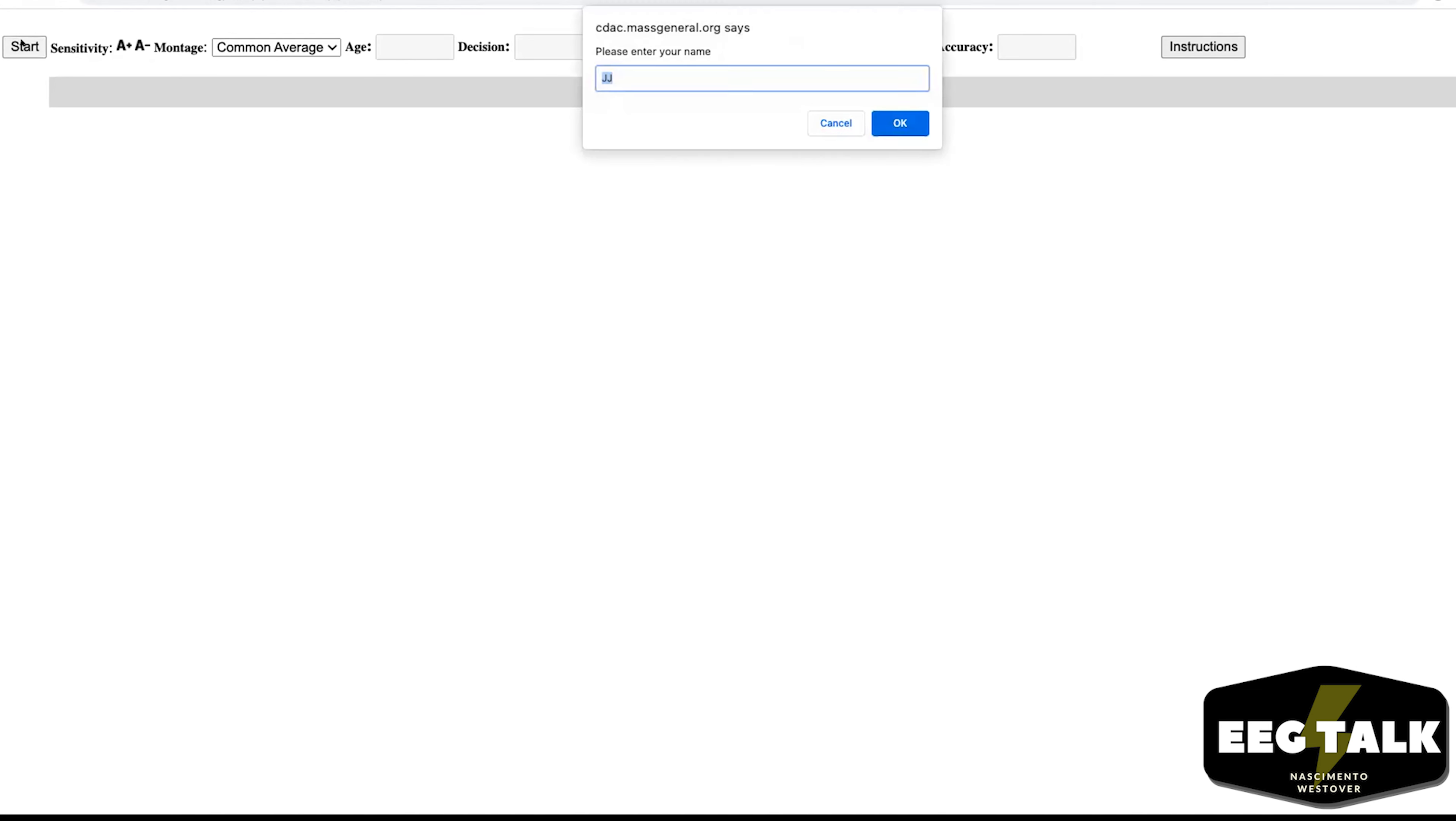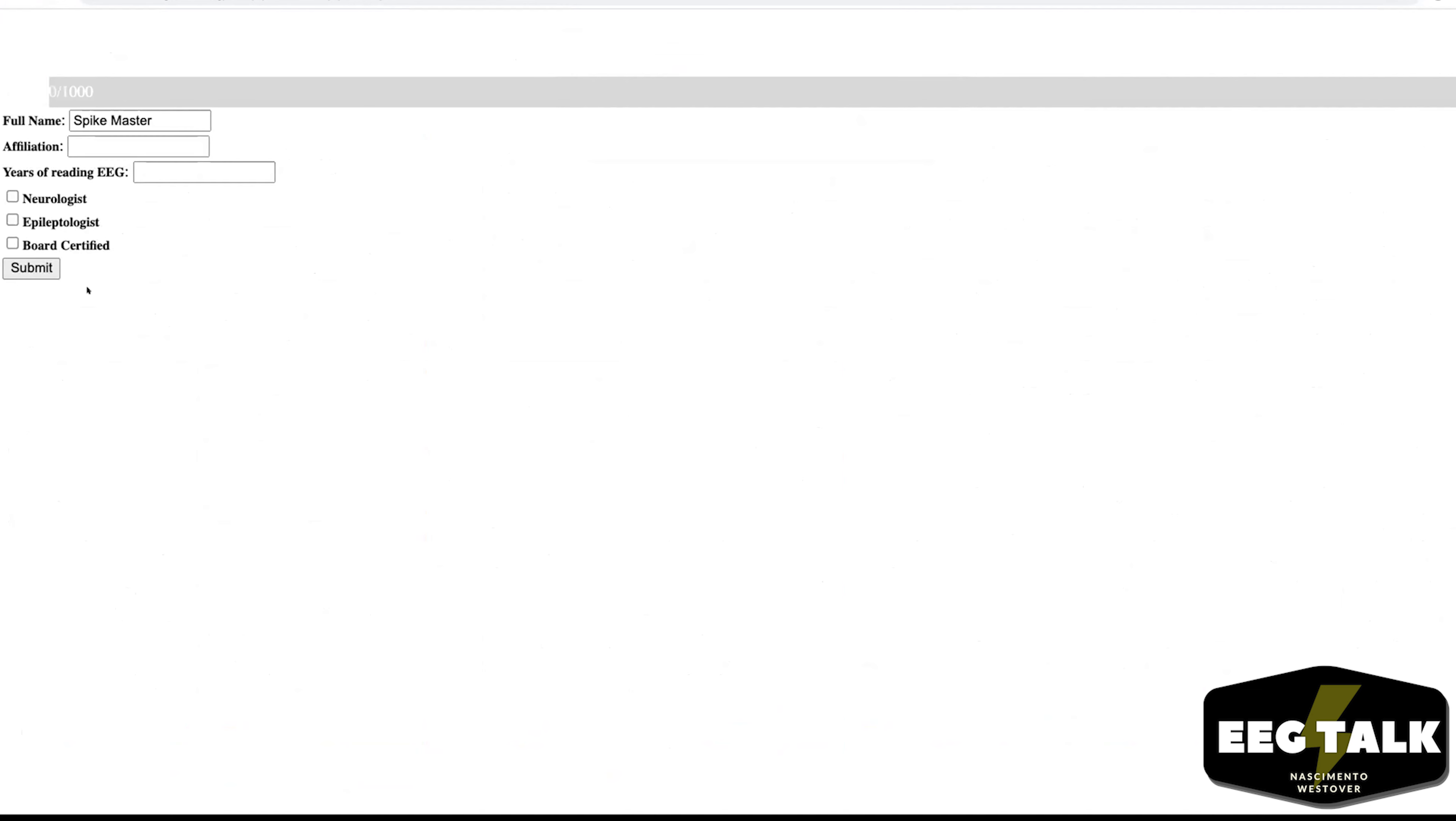Well, it looks like we've got it up here. Do you want to walk us through it a little bit? What do you do first when you get to this screen? You have to register or sign in using the button start. Okay, you are asked to enter your name, for example, Spike Master.